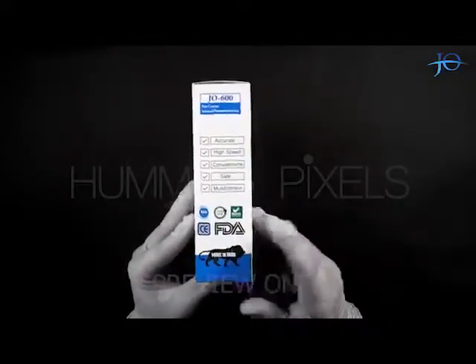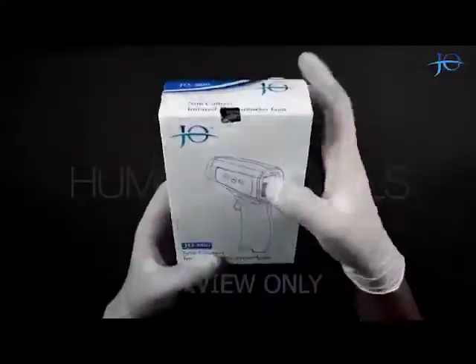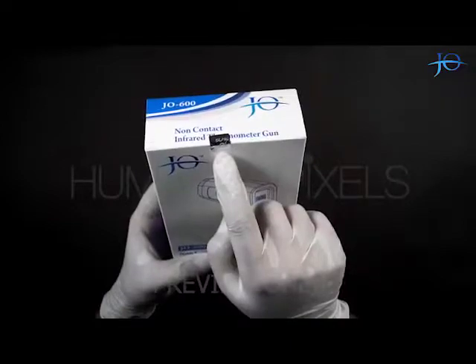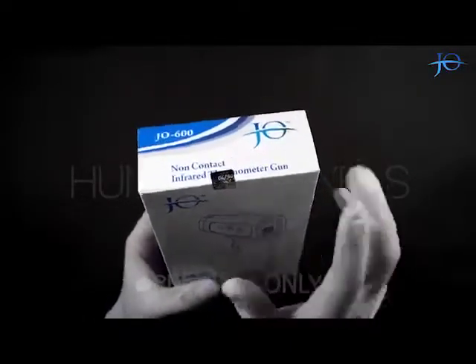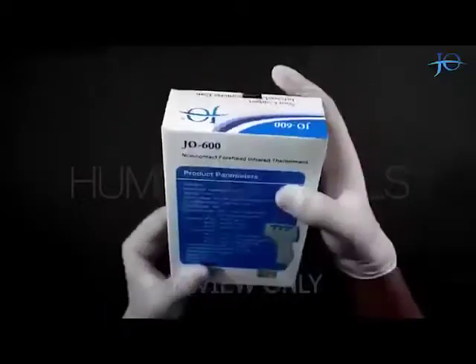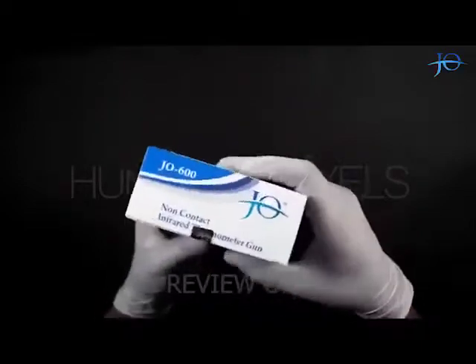It's a Make in India product. The model number of this product is JO-600. It has a void seal on the top of the box, which has the company name on it along with the manufacturing date, verifying its authenticity. The packaging is very good and has a JO Pharma Pvt Ltd trademark logo on it.